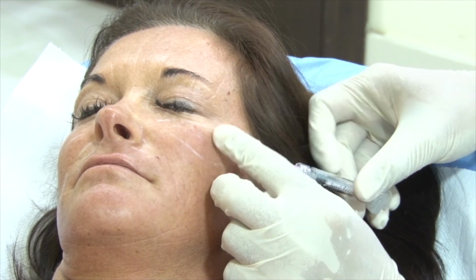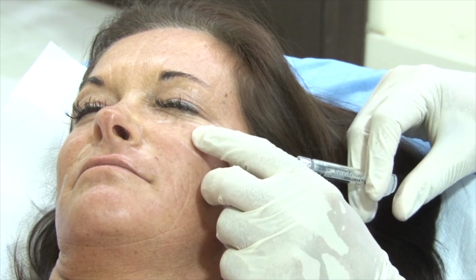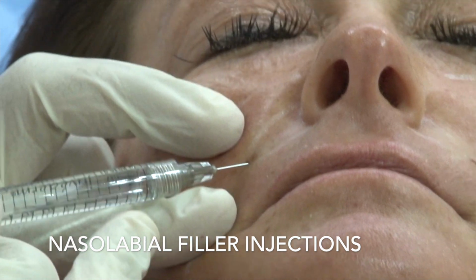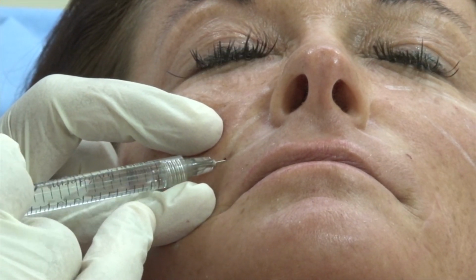Similarly on the other side, just additional 0.1, 0.2 ml. Then I will inject the nasolabial region. I will use a needle technique.